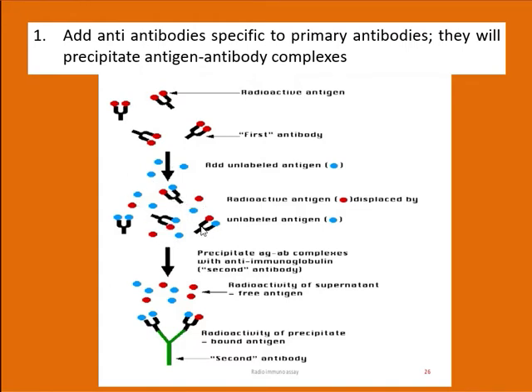How can you separate them? You can separate them by centrifugation, but for centrifugation the antibodies should be complexed, for which you add a secondary antibody, by which you can precipitate these primary antibodies. By the addition of the secondary antibodies, the primary antigen antibody complexes can be precipitated.